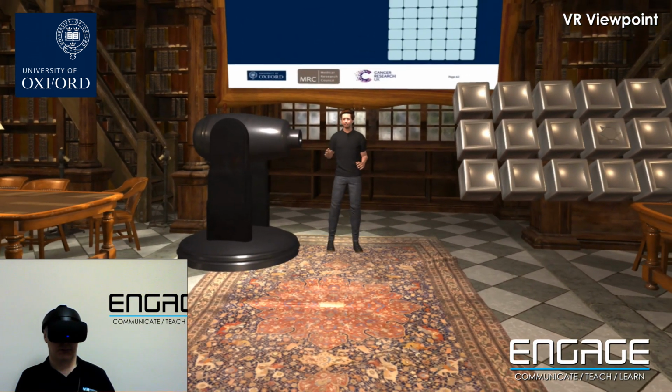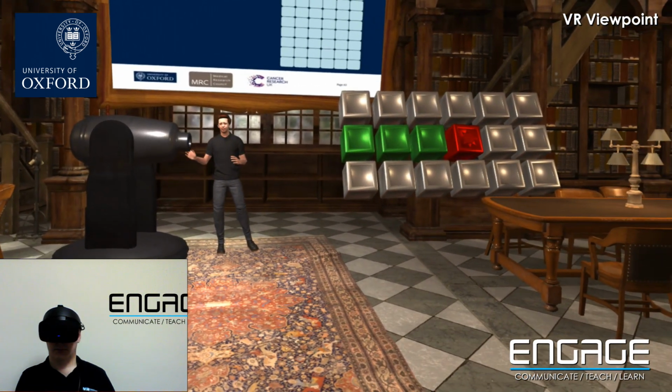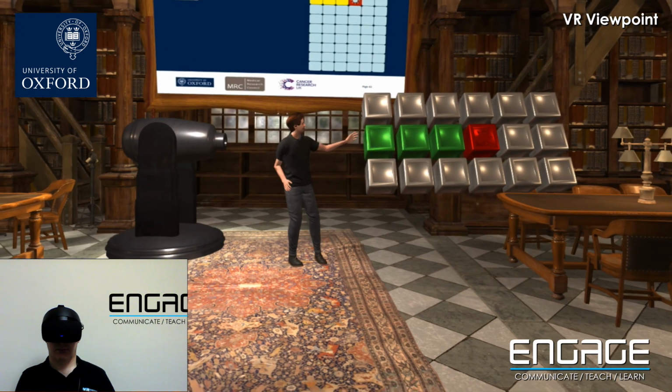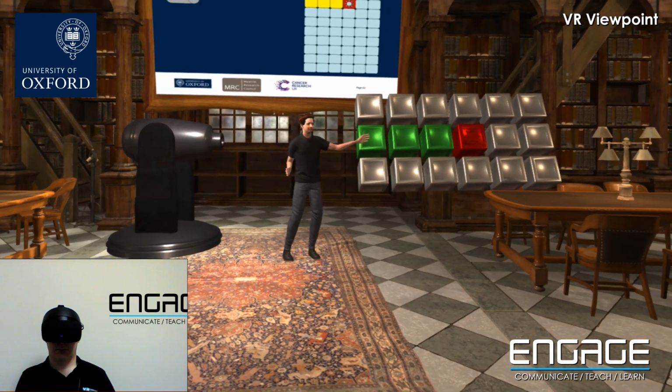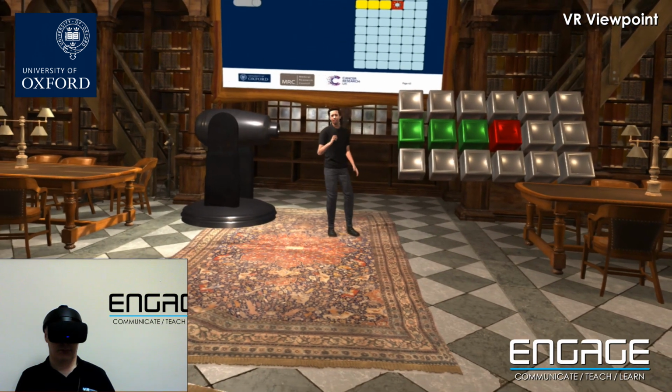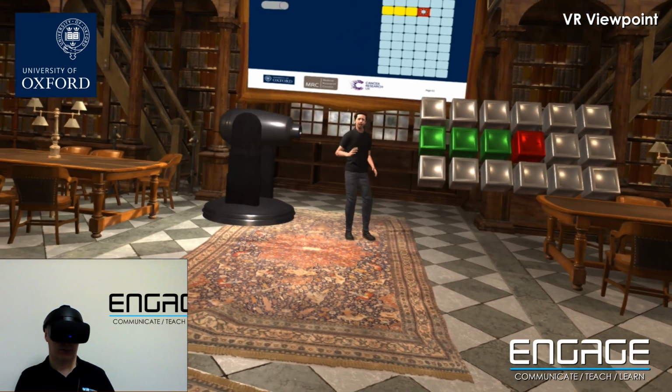So here's my beam, here's my cannon, it's firing these little protons into the patient. And if I've adjusted the beam so that the protons stop in this square here, that's where most of the energy will be deposited, that's where most of the damage will be done. If that is the tumor, then we are in a happy day.